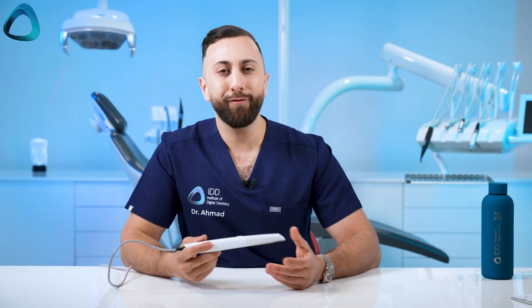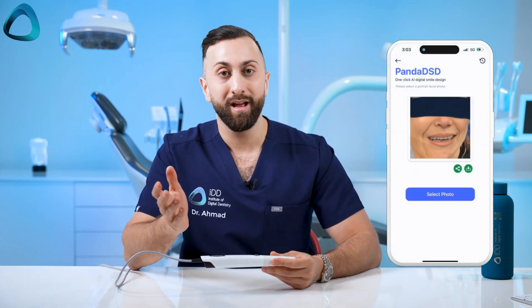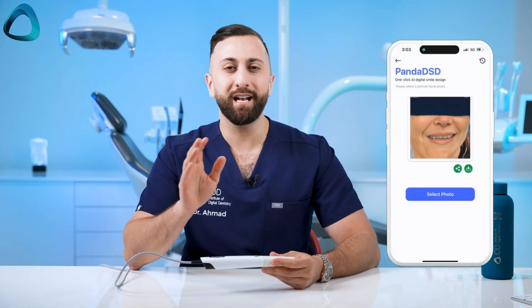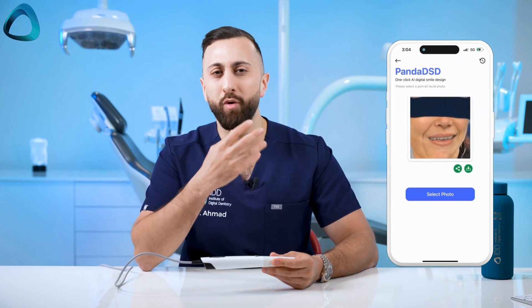With one picture and one click you get a smile design with decent textures — something that can actually be shown to patients, not the cartoony appearances you often get with other smile design software. The Panda app takes it further and generates a short video simulating speaking and smiling, which is quite cool and caught me off guard. It is a little uncanny, and I'm not sure what patients would think, but from a single photo you get a moving video.